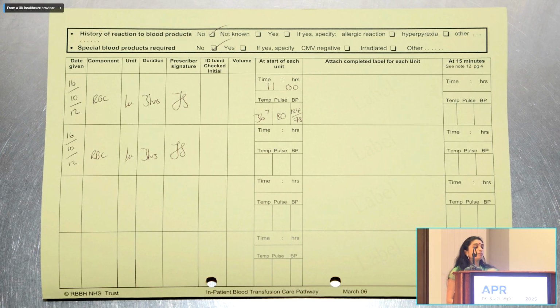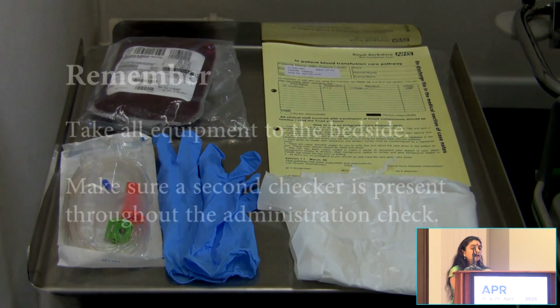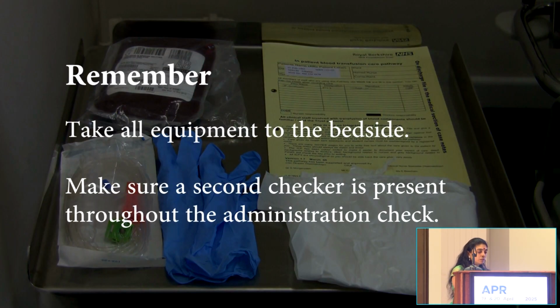This is the blood transfusion reaction record and patient monitoring sheet. These are the paraphernalia you will require: a blood administration set, gloves, the blood bag which your patient is supposed to get, a compatibility slip issued from the blood bank, and swabs.